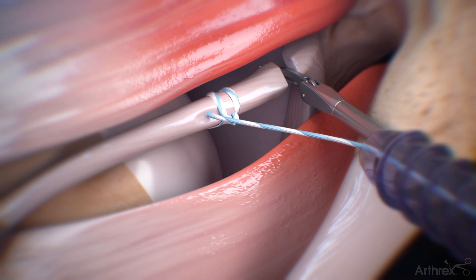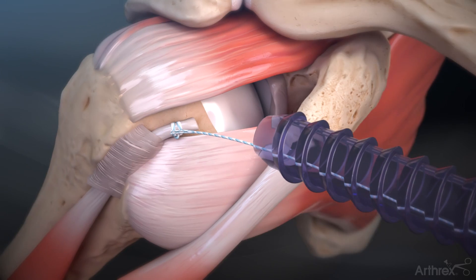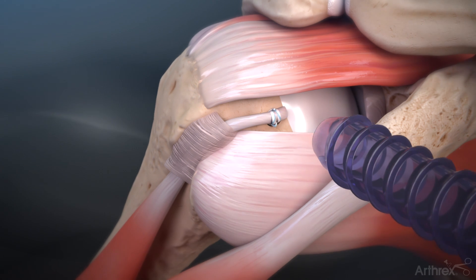Resect the biceps tendon with a curved scissor at its insertion on the superior labrum. Create a socket with a punch and fixate the tail end of the suture tape fiberlink suture with a swivel lock suture anchor to complete the repair.